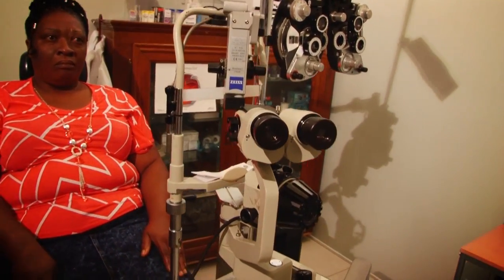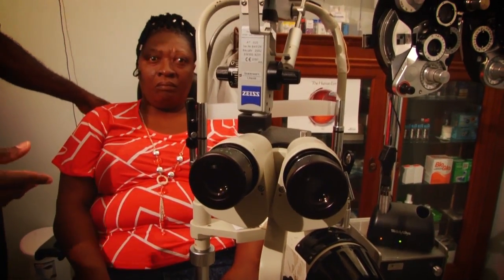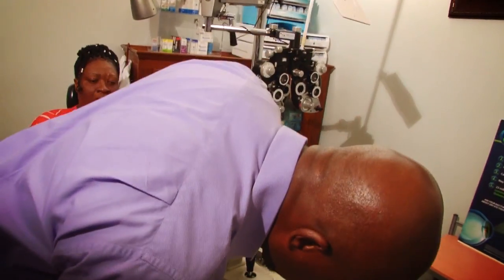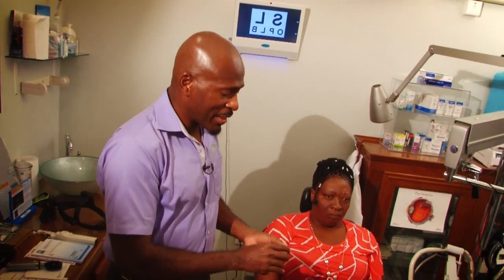They will be examined at a slit lamp, which is a microscope, which is this device. And this will show me events happening at the front of the eye, on the surface of the eye, in the lens of the eye, and also in the retina. And it's simply a microscope. Okay, so it carries a light, and also we can use lenses to view the retina through the pupil at this device, and it's very, very important information.